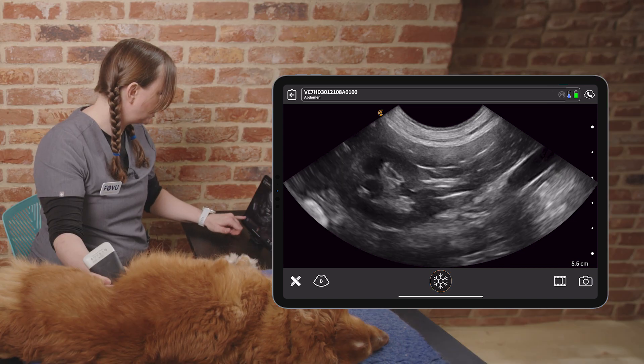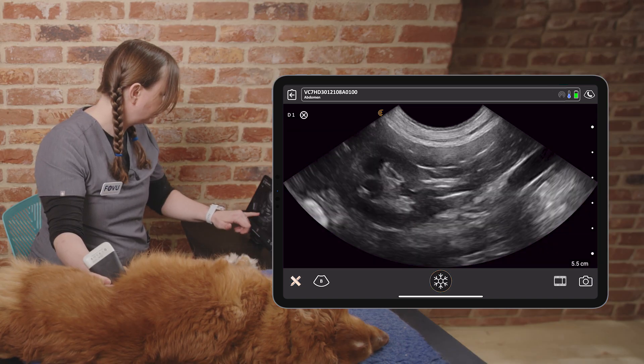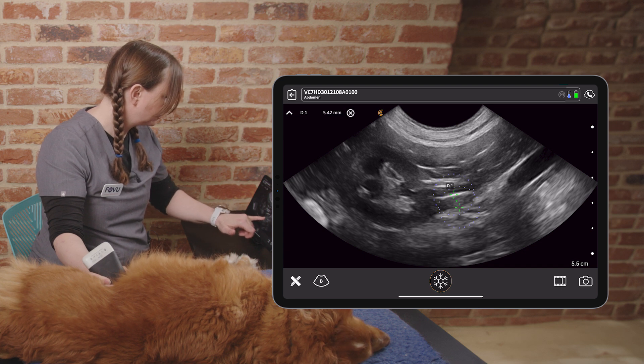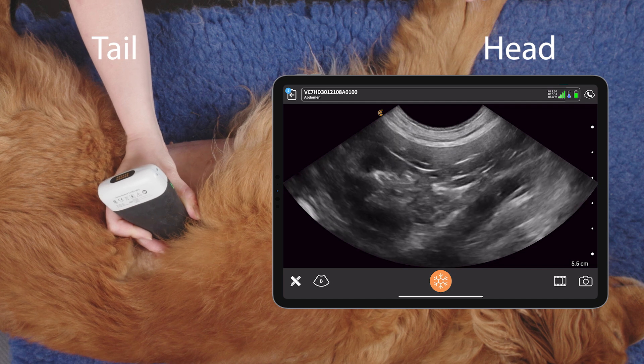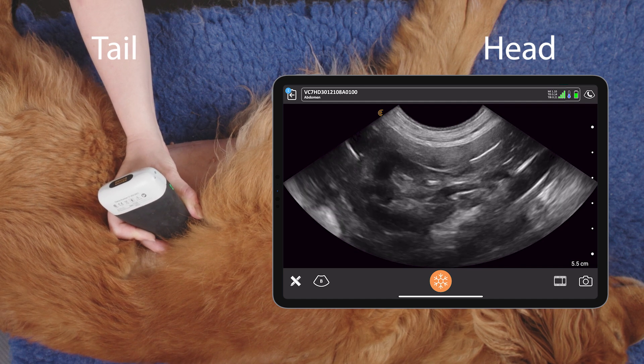We can take a measurement of the caudal pole like so. We can see our landmarks there.